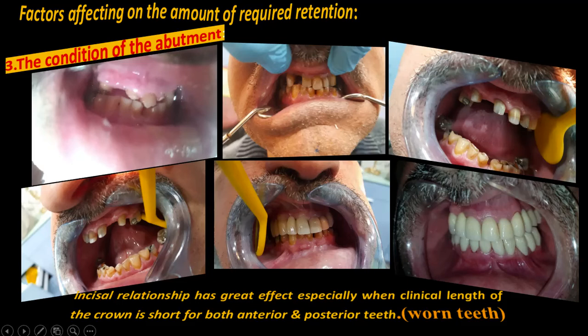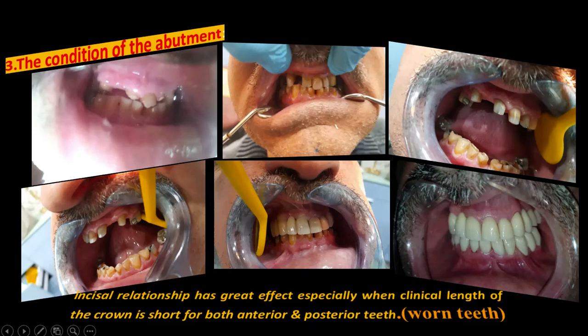of the patient. Then نشوف بعد ما رفعنا ال vertical dimension بعدين جينا سوينا preparation teeth. Okay، مثل ما نشوف ال preparation and then we do a zirconium bridge for the patient. Okay، zirconium upper and lower bridge. طبعا هذا المريض حتى يتعالج أخذ وقت تقريبا 6 شهور 8 أشهر، يعني مو بيوم واحد. يعني you open the bite, you increase vertical dimension, you build the abutment teeth, root canal treatment, and lastly you do your crown restoration.